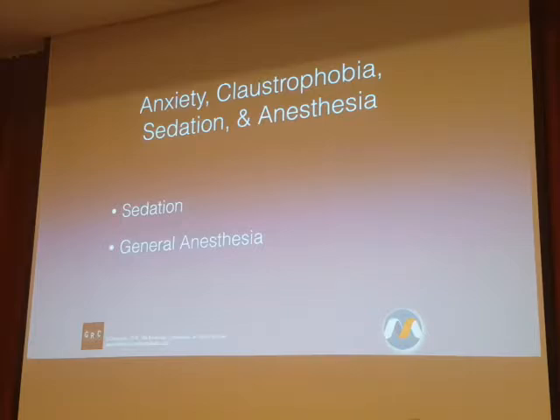Sometimes it may be because they feel as though their title as physician means that they can do whatever they want, wherever they want. Maybe they feel as though they don't really need to follow the protocols of an MRI environment for safety, for screening, for their own individual activity. Maybe they don't feel like their equipment should really be subject to the inspection of the MR staff or review of what they're going to purchase.